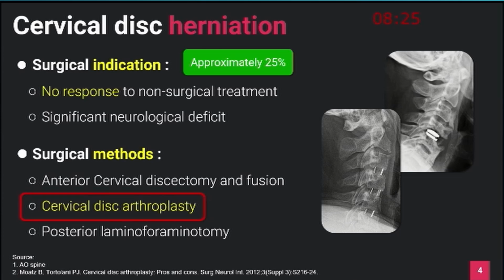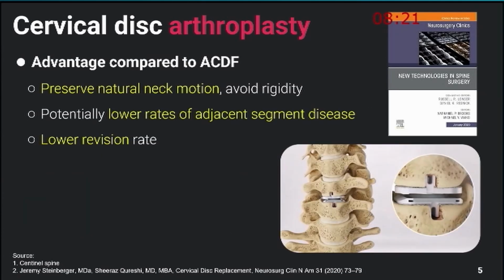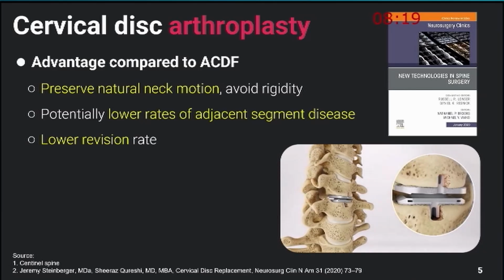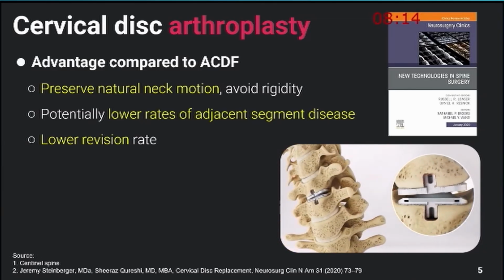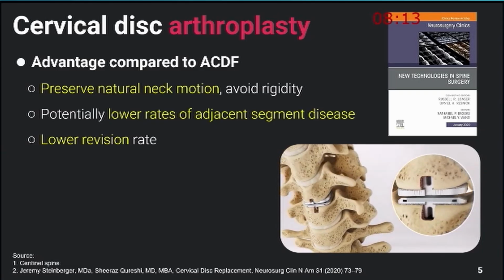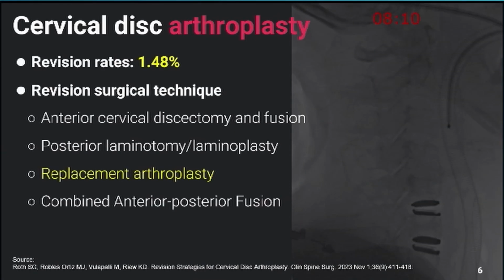Compared to ACDF, CDA has some advantages, such as its ability to preserve natural neck motion, to avoid rigidity, and to lower rates of adjacent segment disease and revision. Thus, there is still 1.48% that need revision.